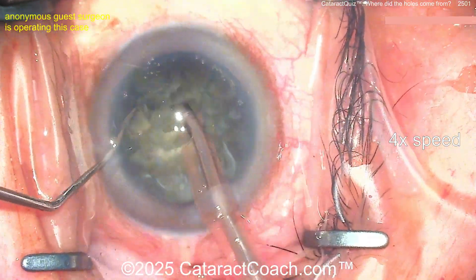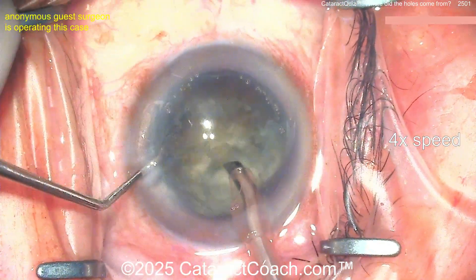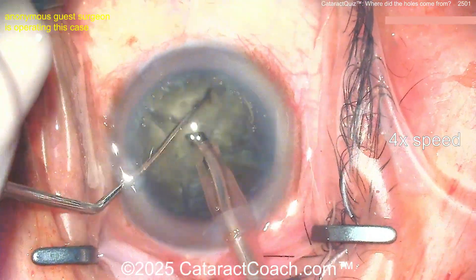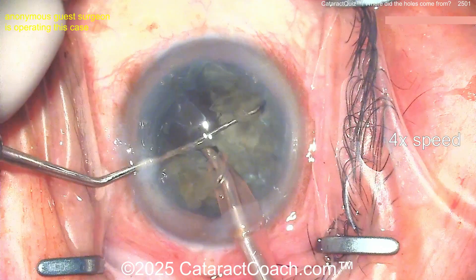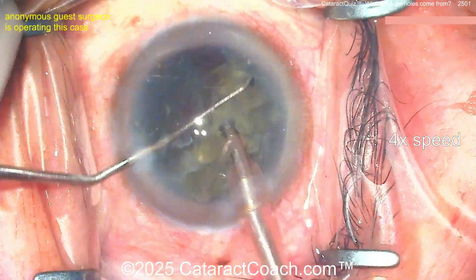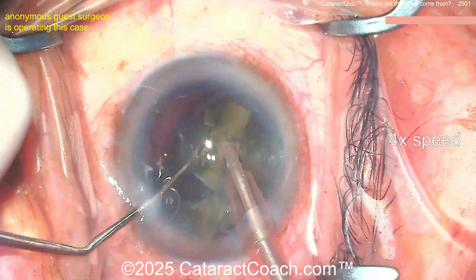Taking the pieces out — everything behaves normally. The fluidics look normal; I don't think there's any complication of the posterior capsule just yet. A nice chop there, beautiful chop — surgeon chops again and takes these pieces out. Now let's watch carefully as the pieces are removed: is there going to be contact with the posterior capsule with that phaco tip? Taking these pieces out — looking good. Aspirate those, get them down.